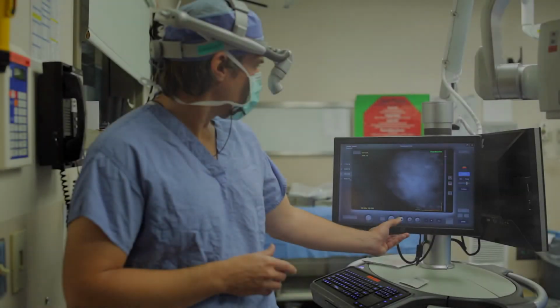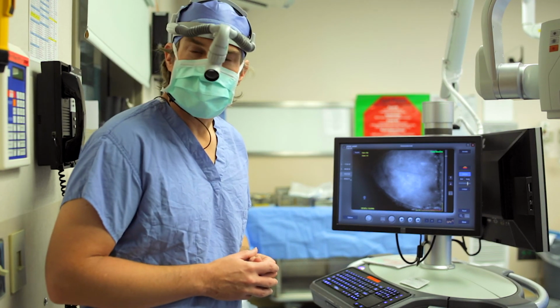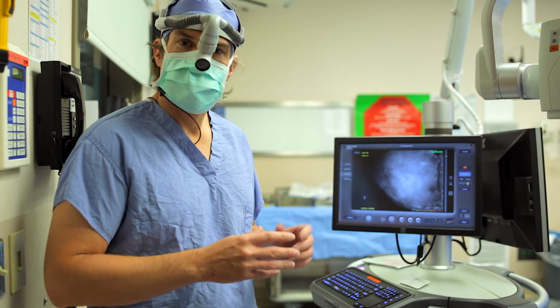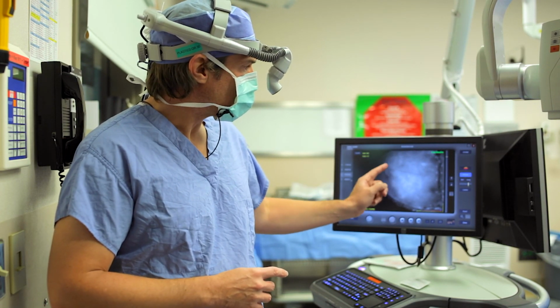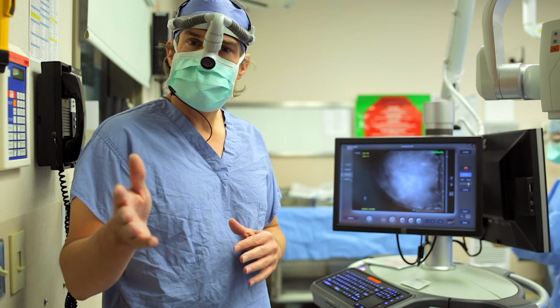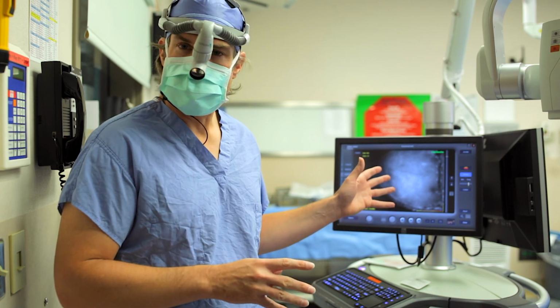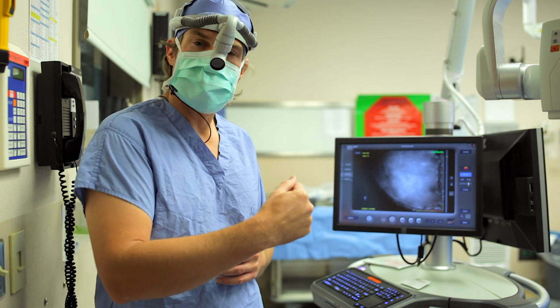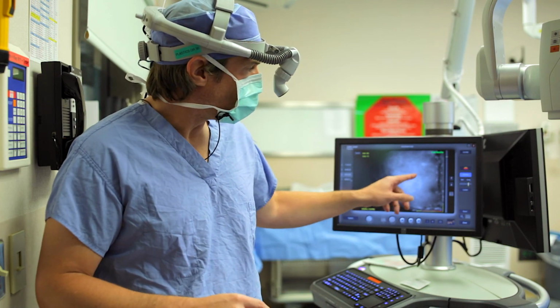Interestingly, again, I'm going to take a pause right there. You can see that appendectomy scar coming right across there. And the way we raised this flap and with the blood vessels that we preserved, we were able to perfuse both skin and fat above that scar, as well as below that scar and lateral to that scar. And we were able to do that safely, but then we could measure intraoperatively how good is the blood flow, how much of this flap can we take. And while that scar played a part of the operation and decision making, we can be absolutely certain when we transfer that flap that it's not going to have an issue with regards to flow, blood flow around that scar.